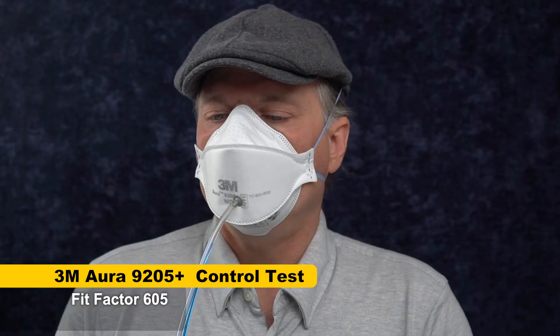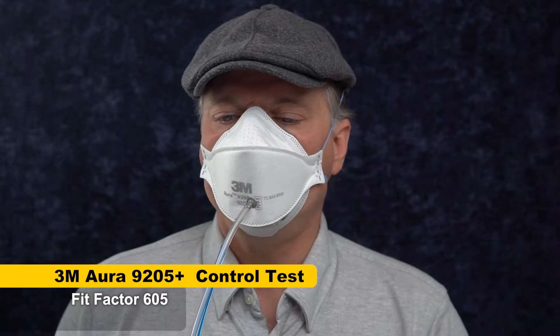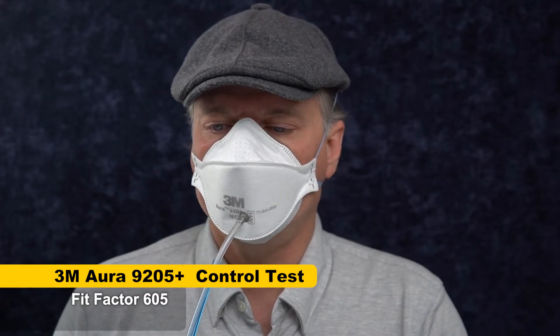Okay, 605. That's a good score, a very good score for an N95, and in the typical range that I get for a 3M Aura. So the control mask is good.